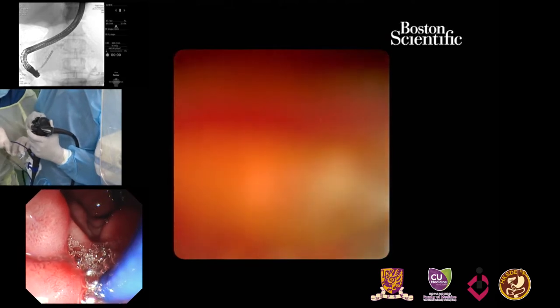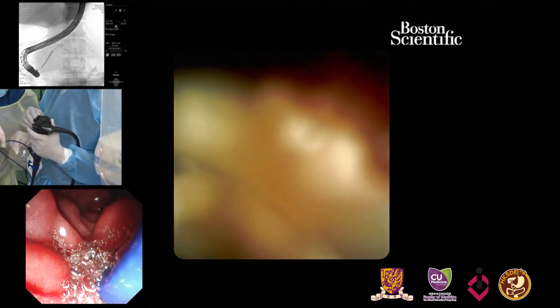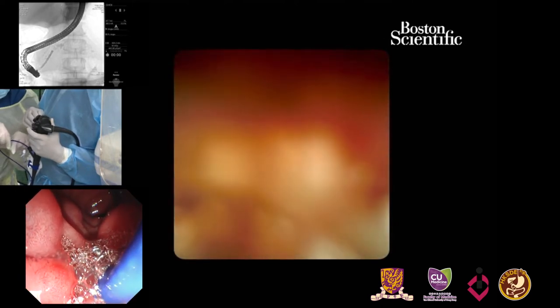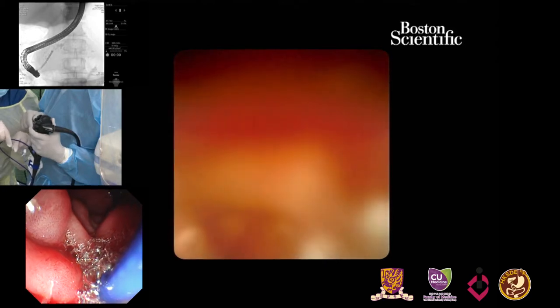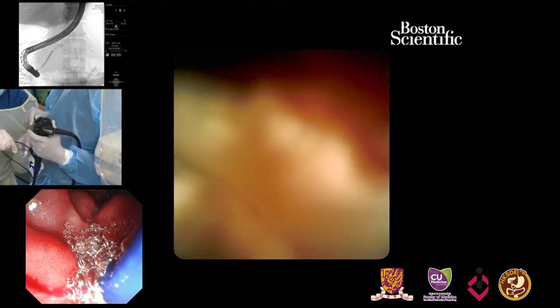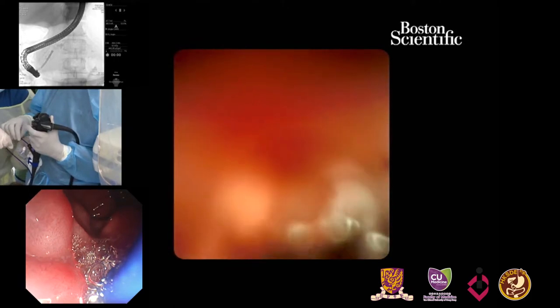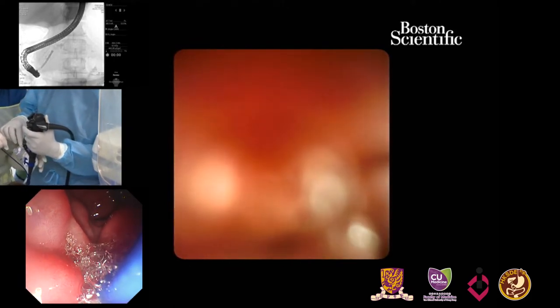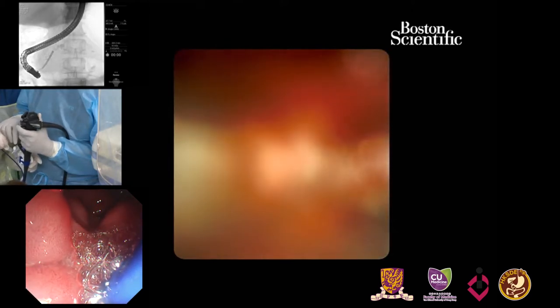Okay. I think the one benefit with the new spy system is that it's a little bit easier to pass your accessories through. I've noticed. They say 1.2. This is 1.3, I think. The view with the second generation digital spy is fantastic. Compared to last year, we're getting a much better view, and the catheter itself is much more flexible. Now is there resistance? The actual spy scope itself is 10 French.